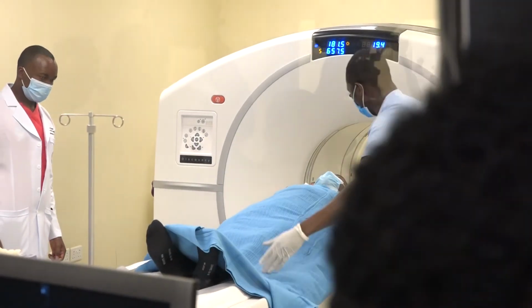Okay. How accurate are these images, perhaps compared to the former forms of testing? So earlier what we had was more of conventional imaging, whereby we used to get 3D images of the body structures anatomically. And what PET does is it gives a combination of both functional image as well as the CT part, which gives the anatomical correlation. So earlier we used to know whether there is some kind of lesion in the body, but we didn't know whether it is still metabolically active, it's growing, or it is having some other impact. So with the advantage of both PET as well as CT, we get to know the metabolic activity of the particular tumor and also the exact location. This is something which was not found in earlier conventional imaging. So this will be a big boost for the management of cancer and diagnosis.